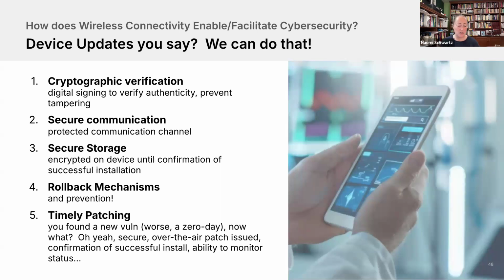And I also want timely patching. So when you have a medical device and something goes wrong, there's a new vulnerability, or worse, a 0-day, I want to be able to rapidly triage that and get updates out to the various devices. I worked through a bunch of those while I was at FDA, like Urgent 11 and Sweyntooth, where we're on the phone all day calling people. Are you affected? Have you checked if you're affected? What can you do if you're affected? What's the risk? Can you disconnect the device from the network locally at the hospital? Can you take it off of Bluetooth or Wi-Fi for a period of time? If not, what could go wrong if you leave it on? How do you communicate that to customers? Fast, like today, fast, right?